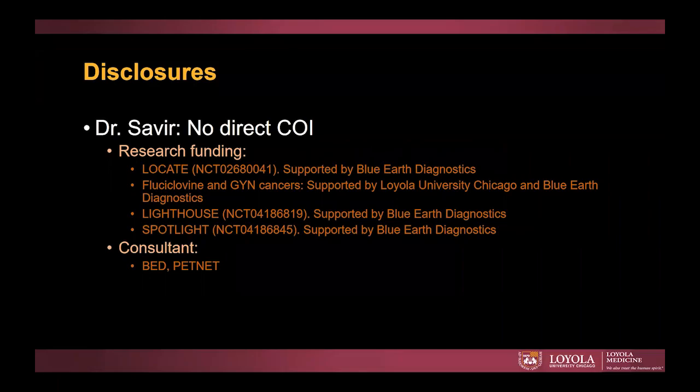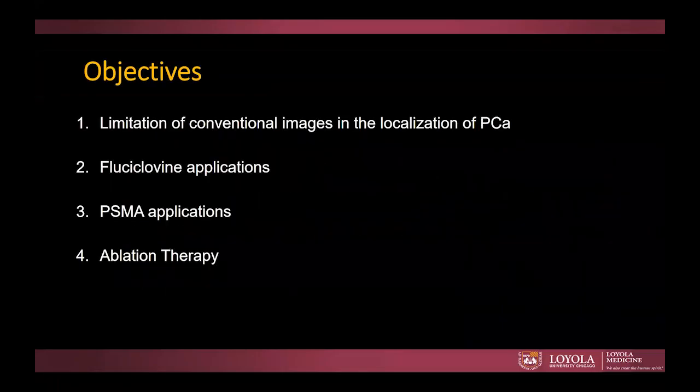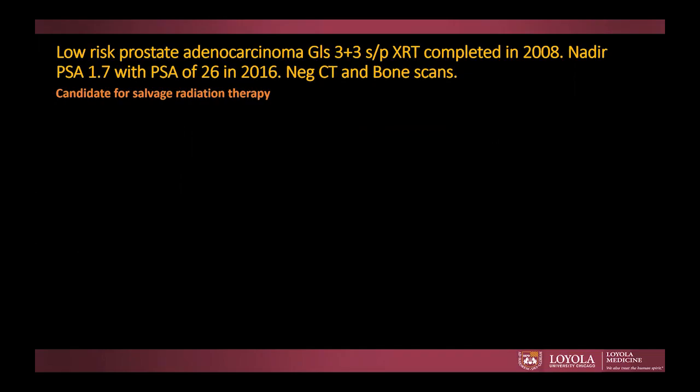Those are my disclosures. Today in this educational lecture, we'll cover the limitation of conventional images in the localization of prostate cancer. We will speak about the application of fluciclovine and PSMA, and we will really briefly cover the concept of ablation therapy. So let me start with a case.